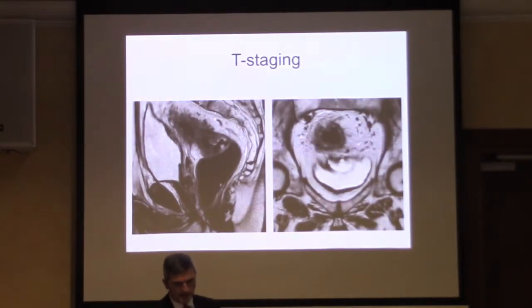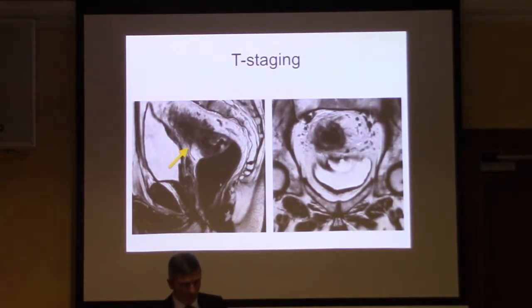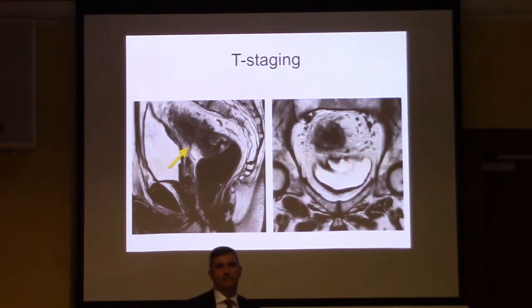Okay, this one here, the peritoneal surface is coming up. You can see that little black line, the arrow. So the tumour here has grown onto the peritoneal surface. So this is T4A disease. And there's nothing the surgeon can do to change that. They can do the nicest operation they like, but it's not going to change that aspect.